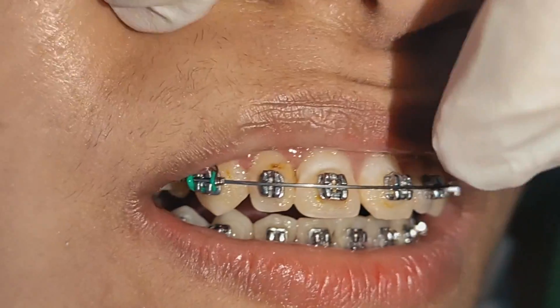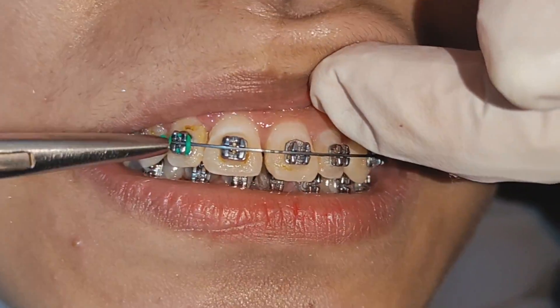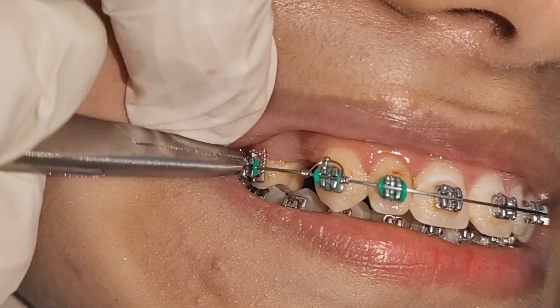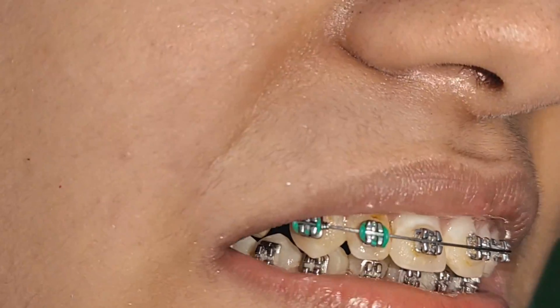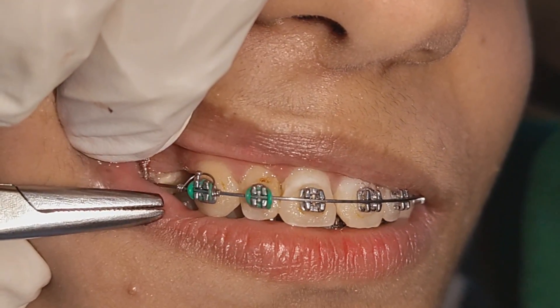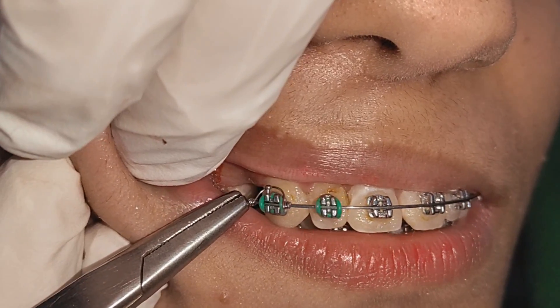You can also use metal ties using ligature wire. The torque spring can be fabricated over rectangular steel wires in different sizes. You can use 16 by 22 or 19 by 25, but it must be in tight contact with the wire. That will make the spring generate force when secured over the wire.